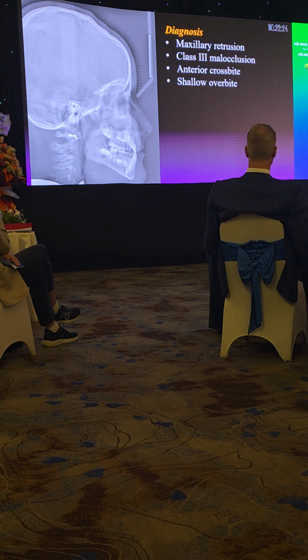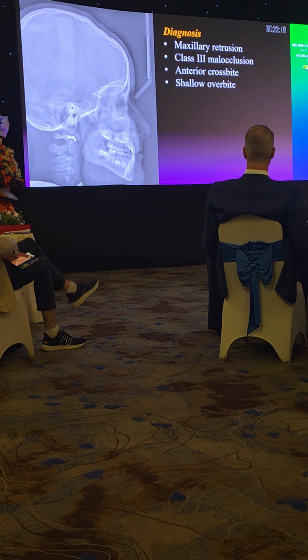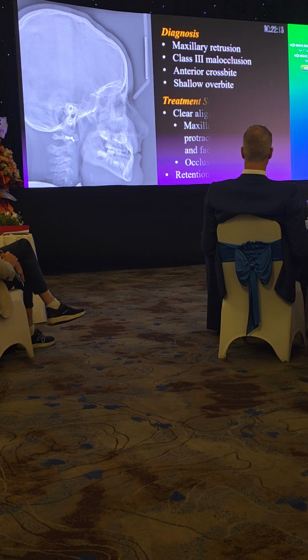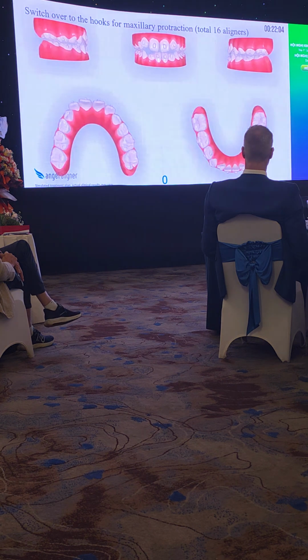Oh, have you ever done that? You have done that. Is it successful? Now you guys better go to this guy over here, all right? I'm going to show you how I did it. So, yeah, I have a bite plane, but that's not to jump the anterior cross, because I'm going to be using clear aligners, all right?